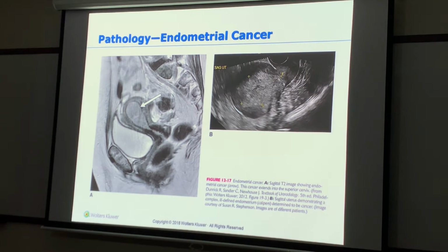I could even do chroma, which changes the color of the anatomy. Have y'all seen that yet? Okay. Because sometimes chroma will help you define anatomy. If you know something's there, do your best to work your machine so you can see it. Okay. And you write in the report, you suspect complex endometrium. That's all you say. You're not gonna make a diagnosis. It's not our job to make a diagnosis. Yes, doctor, complex endometrium.